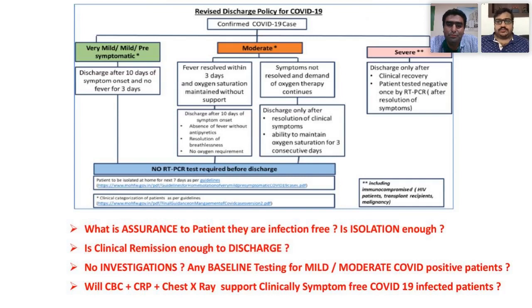I think we have covered the majority of the areas, right from the emergency department to the laboratory services, catering to the department, point of care testing. The utility of a very simple baseline investigation like CBC, CRP may be a game changer sometimes. See, for me as a pathologist, I am always happy when there is a high sensitivity of any of the screening type of investigation.